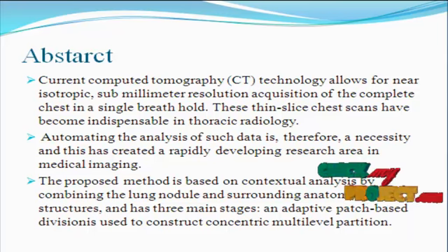Recently, image-based diagnosis in clinical settings has focused on the automated computation of quantitative measures to investigate the correlation among different types of lung nodules. We propose an automatic method to classify lung nodules into 4 different types, for example: well-circumscribed, juxtavascular, juxtapleural and pleural tail. Additionally, since the morphology of lung nodules forms a continuum between the different types, our proposed method is superior to previous methods that classify a single nodule into a single type.